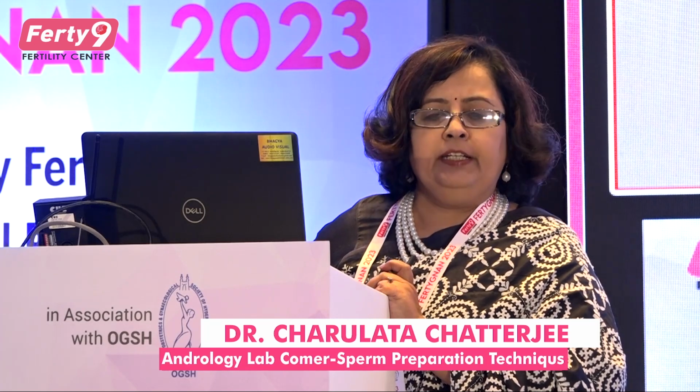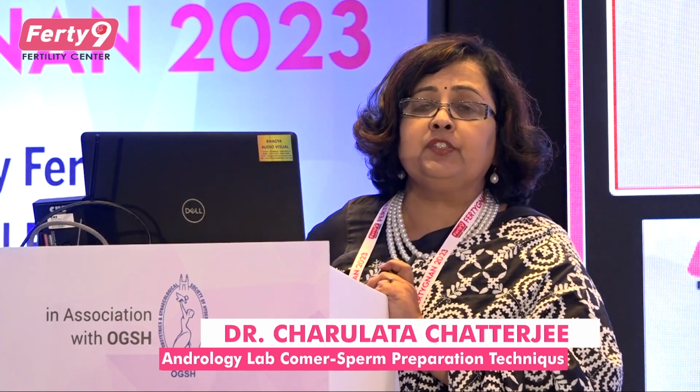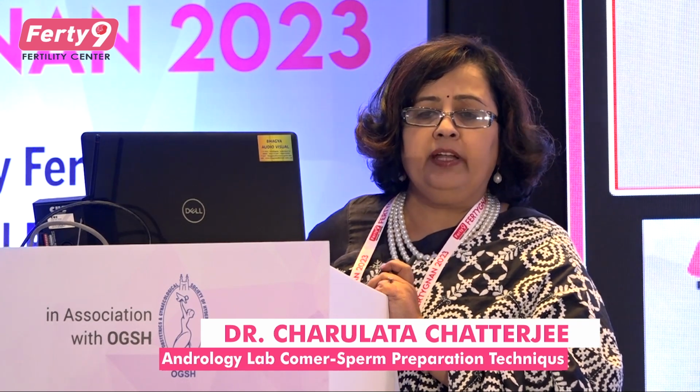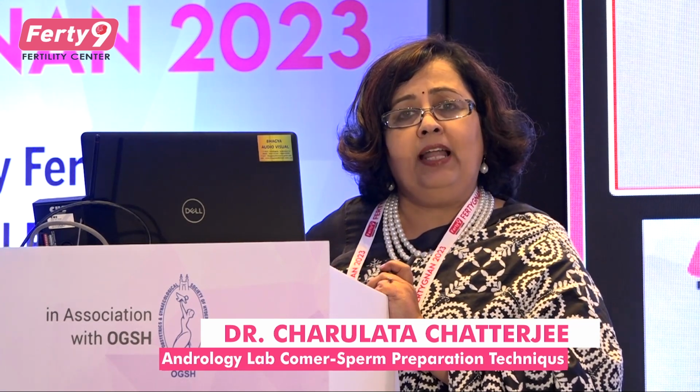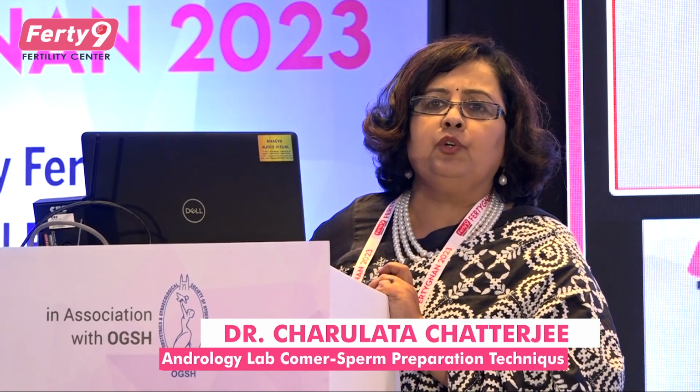We should have the incubator. We should have the centrifuge, either room temperature or temperature controlled. Again, what kind of rotor is there, swing-in model or swing-out model, all that has to be considered when we are establishing the lab for andrology. There will be a Makler chamber to count the sperm sample, total count and motility. There should be media and disposables. So these are all the requirements to prepare the sperm in the laboratory.